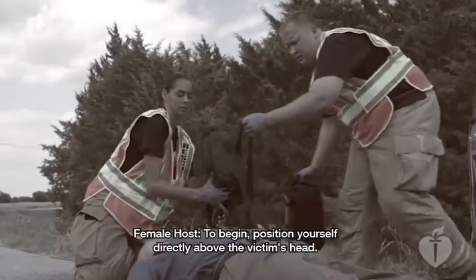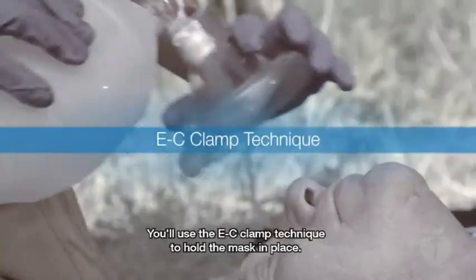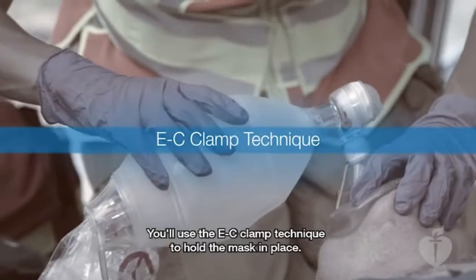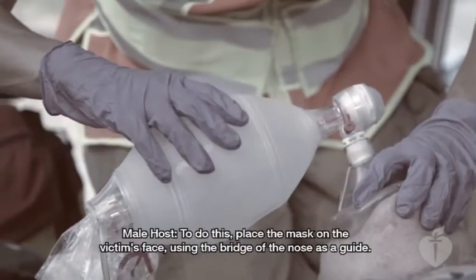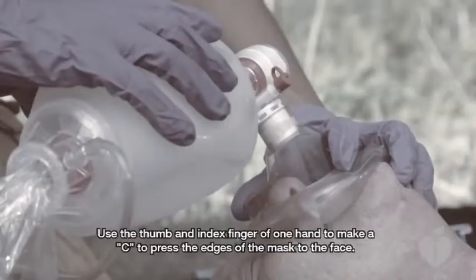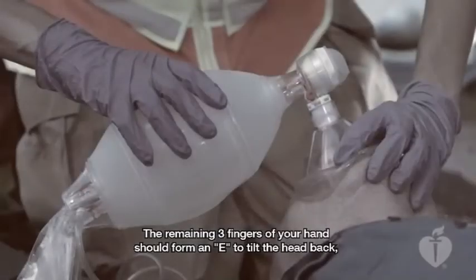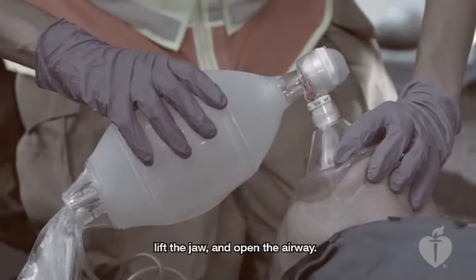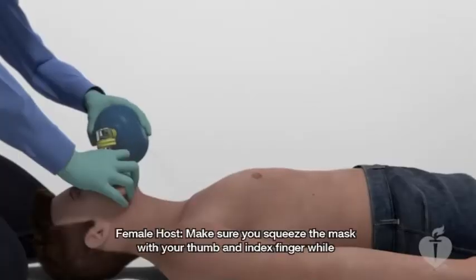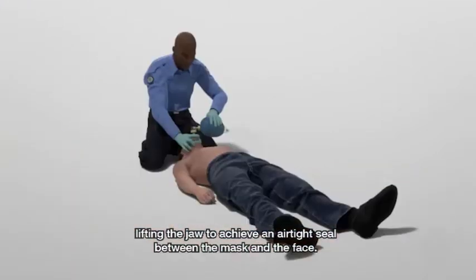To begin, position yourself directly above the victim's head. You'll use the EC clamp technique to hold the mask in place. To do this, place the mask on the victim's face, using the bridge of the nose as a guide. Use the thumb and index finger of one hand to make a C to press the edges of the mask to the face. The remaining three fingers of your hand should form an E to tilt the head back, lift the jaw, and open the airway. Make sure you squeeze the mask with your thumb and index finger while lifting the jaw to achieve an airtight seal between the mask and the face.